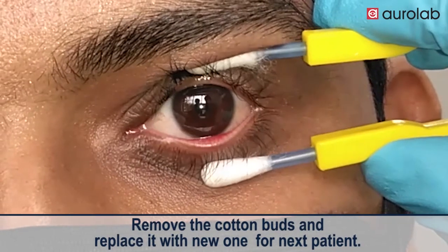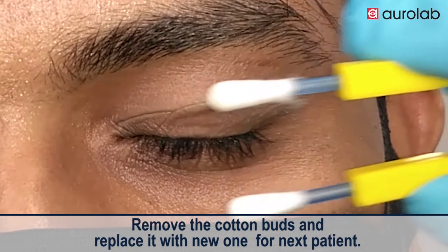Remove the cotton buds and replace with a new one for the next patient.